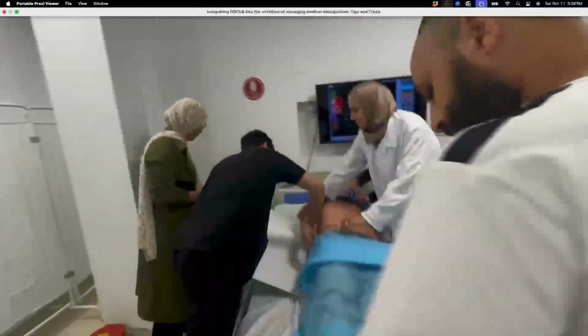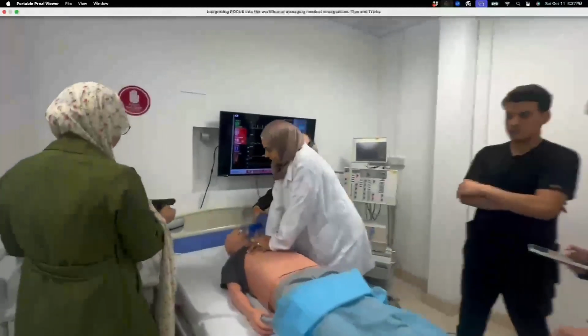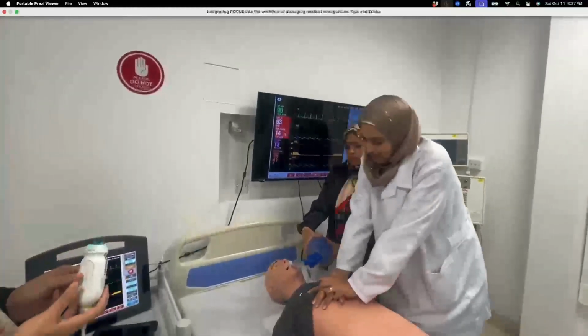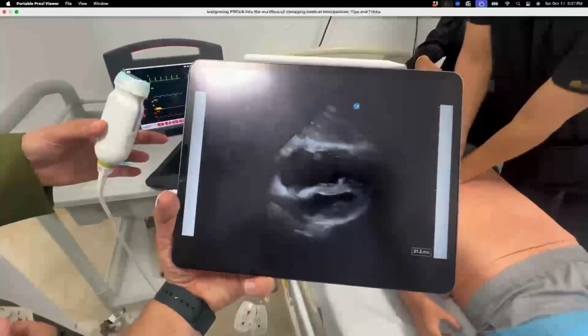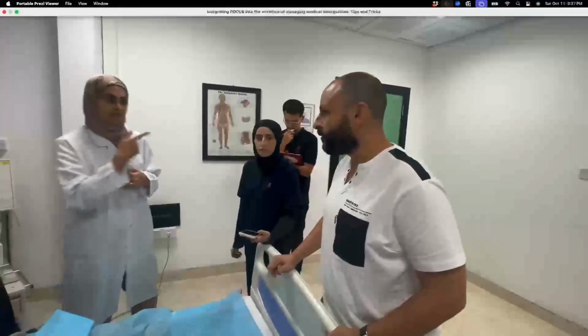So now they're putting a board underneath the patient. Improve compressions, please. Press hard and deep. If you are tired, you can switch. 10 seconds till ultrasound. 3, 2, ultrasound, please. 10, 9. There's a large thrombus in the right atrium. Administer thrombolytics, please. Okay. Now closed loop communication.